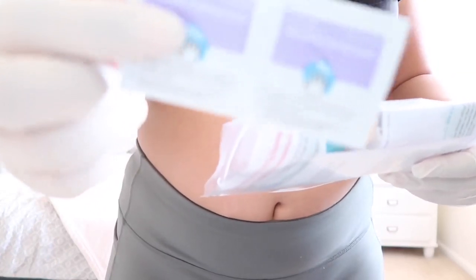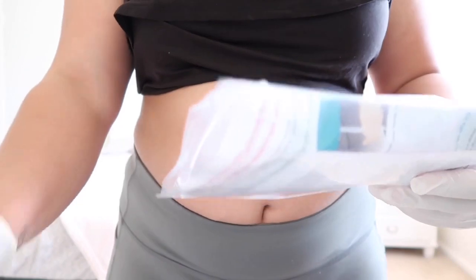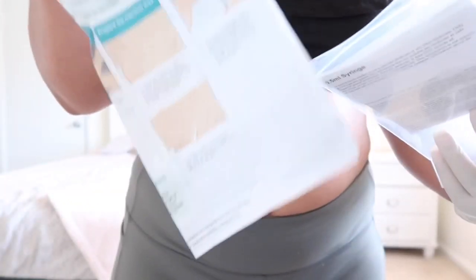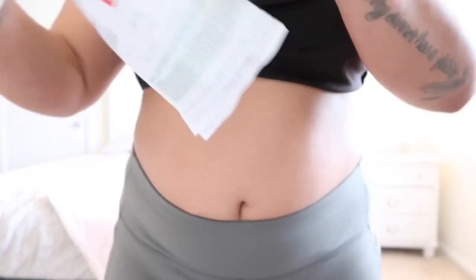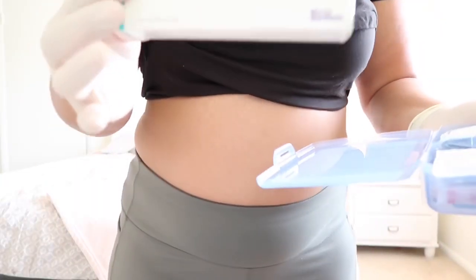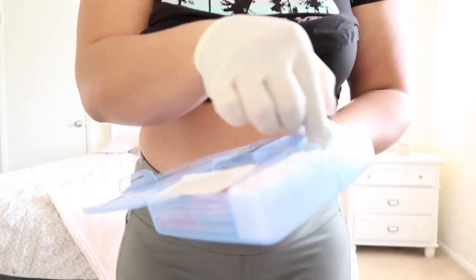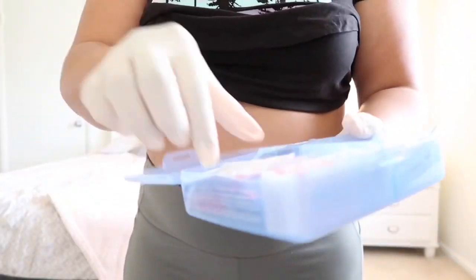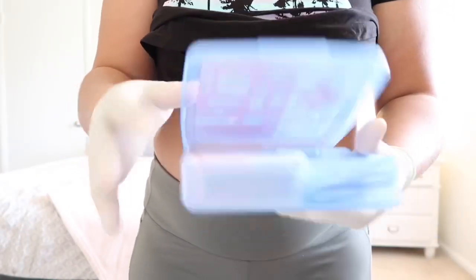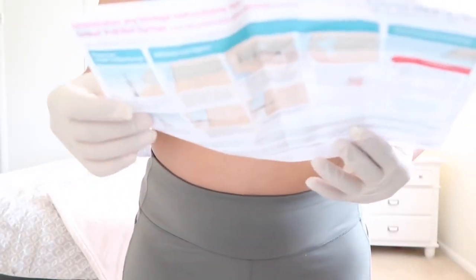I also have these alcohol wipes to clean the area, and I have instructions which I'm going to read. So I have my medicine, the alcohol wipes, the gauze, and a little band-aid just in case I bleed — which I doubt.